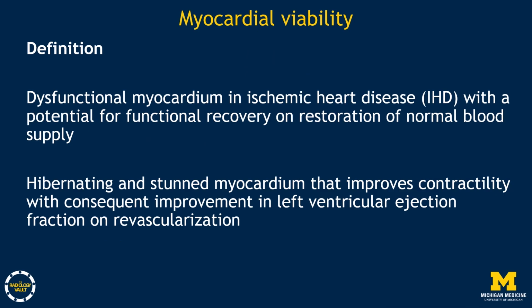Myocardial viability can be defined as dysfunctional myocardium in ischemic heart disease with a potential for functional recovery on restoration of normal blood supply. In other words, myocardial viability implies hibernating or stunned myocardium that improves contractility with subsequent improvement in left ventricular ejection fraction on revascularization.